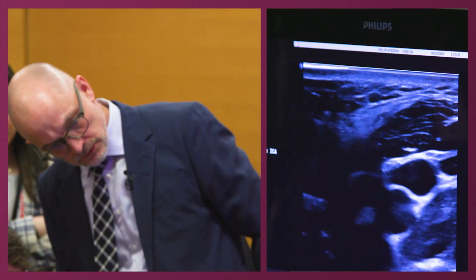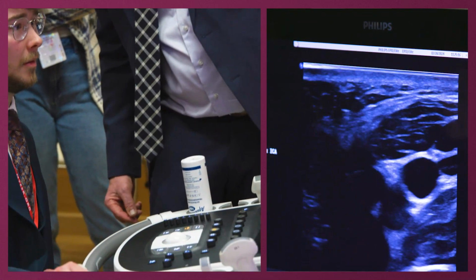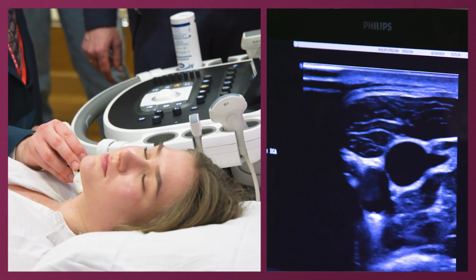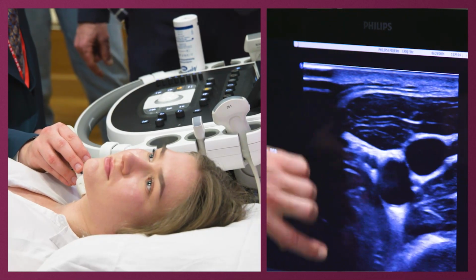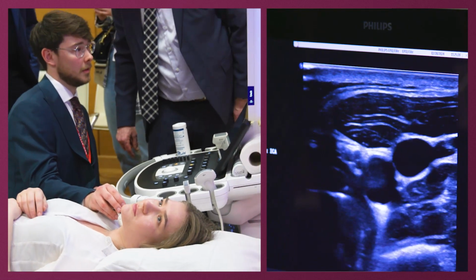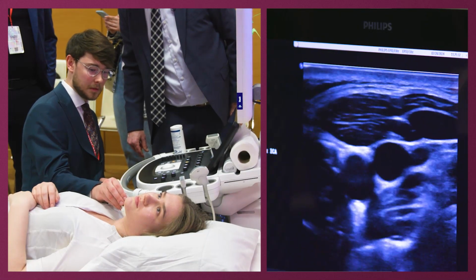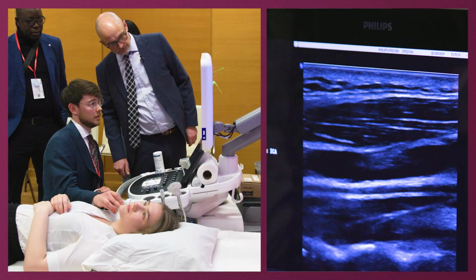Keep it in the center. Good. You can see what's happened here. Yes. Okay. Good. Go back. Back. Okay. Go back to where the neck starts. You see, this is a gel problem. You are lacking contact, but let's just focus. Now you turn longitudinal. No, the other way around. No, you're right. Sorry. Okay. Yes. Like this. Yes.